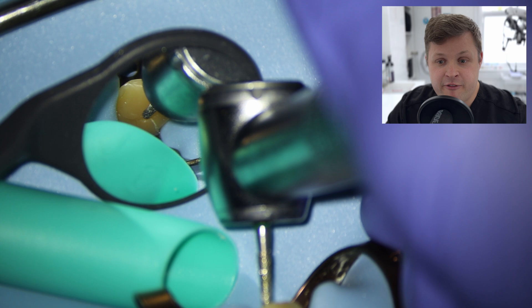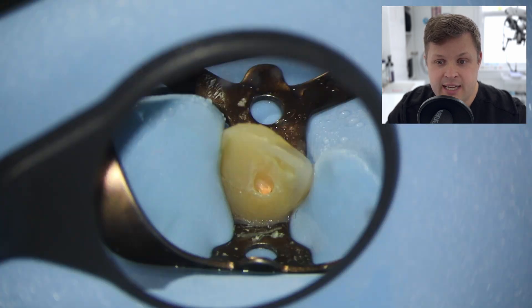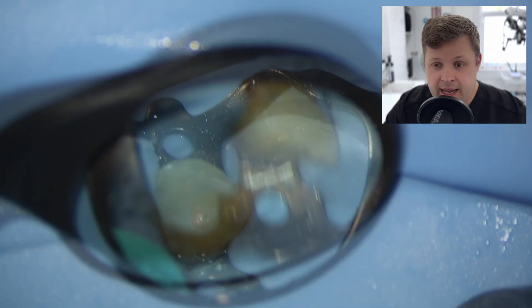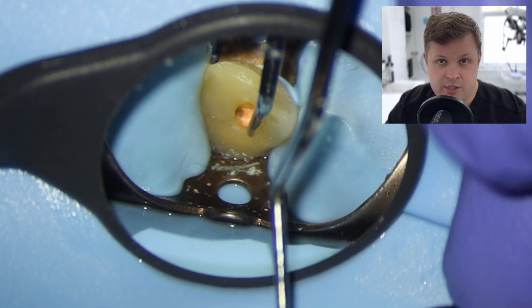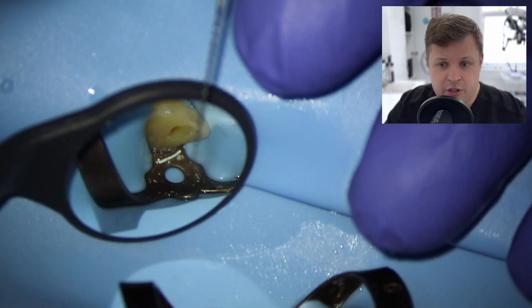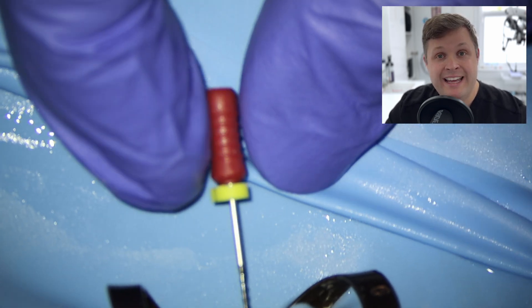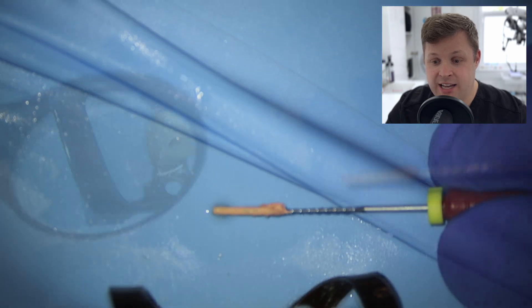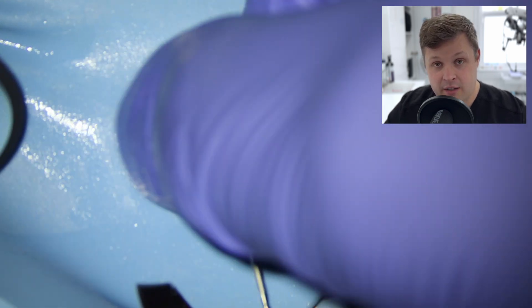In the first instance, I'm going to access the tooth. I've placed rubber dam, and usually when you access a tooth for the first time during root canal you do it without rubber dam, but in this case the GP point is really obvious so it acts as a marker and you can just put the rubber dam on straight away. When I find the GP I'm trying to pry it away from the wall using this DG endodontic probe, and it's quite well compacted. I like to use the screw-and-pull technique — we get a Hedström file, screw it into the GP point, and pull it out. Ideally you want the whole GP pulled out in one, but the GP is coming out in very small pieces, which is annoying.